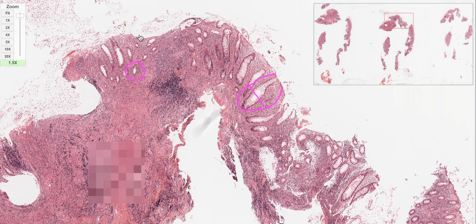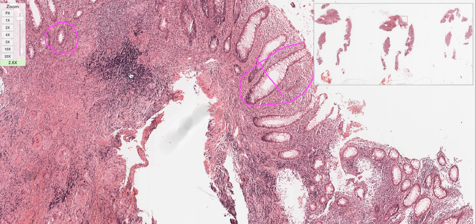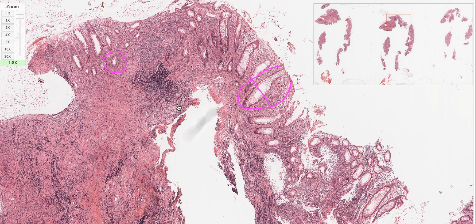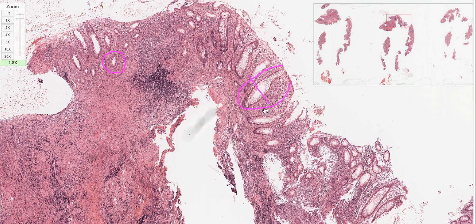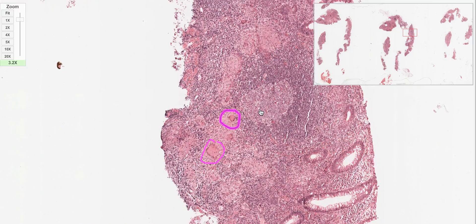One more finding to appreciate: the inflammation here starts from the epithelium, goes down through the biopsy throughout - this is part of a process called transmural inflammation. I'm not seeing a muscularis propria layer here because this is an endoscopic biopsy, not a full-thickness biopsy. So I have three findings: transmural inflammation, cryptitis, and granuloma formation. You would have made your diagnosis by now - it's exactly right, it's a diagnosis of inflammatory bowel disease, Crohn's type.